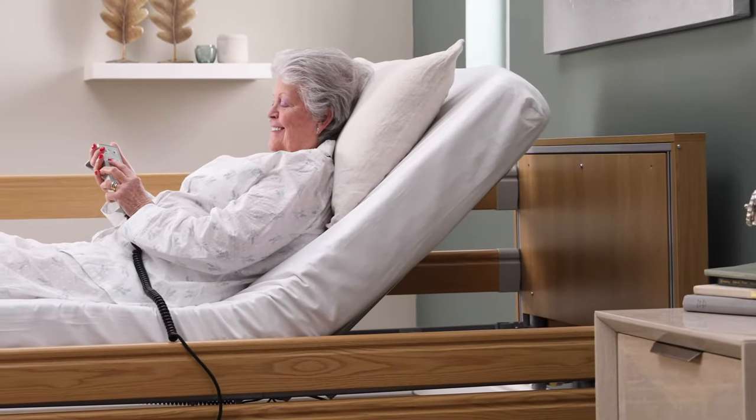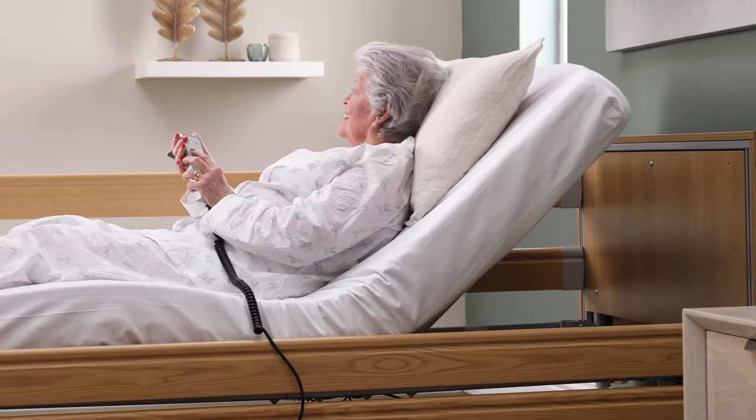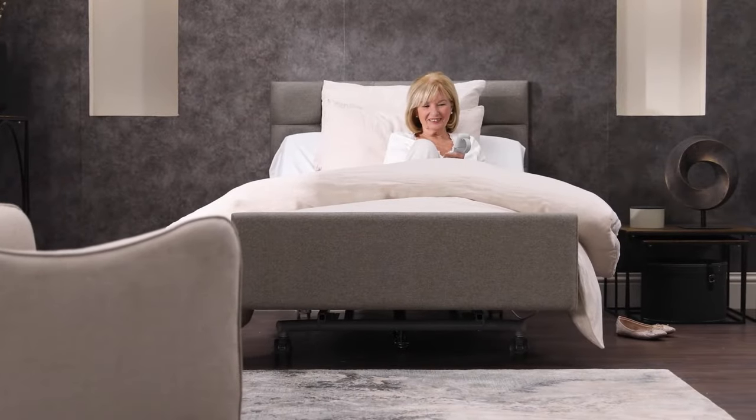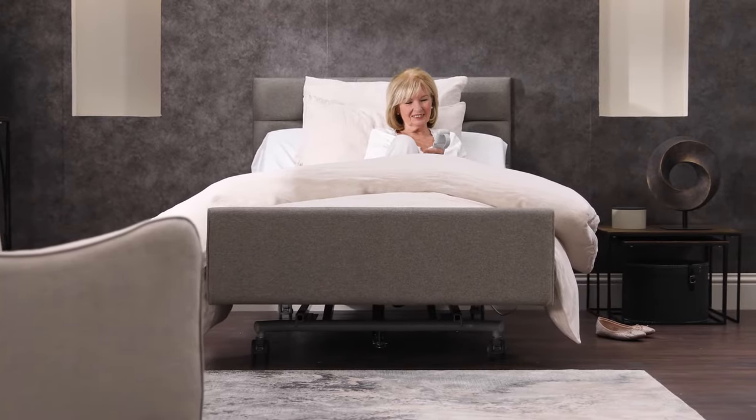Raising your feet is designed to improve circulation and reduce swelling. The knee break setting also prevents slipping down the bed. Height adjustment allows the whole bed to be raised and lowered to your desired position.